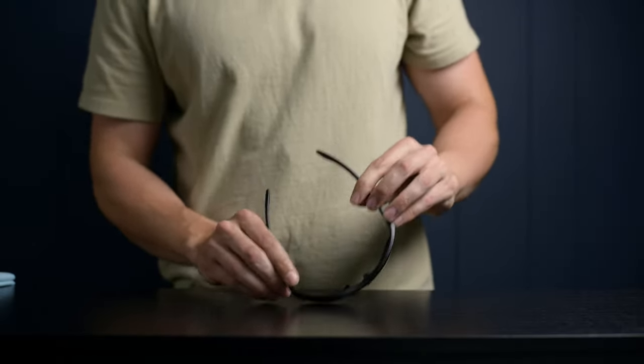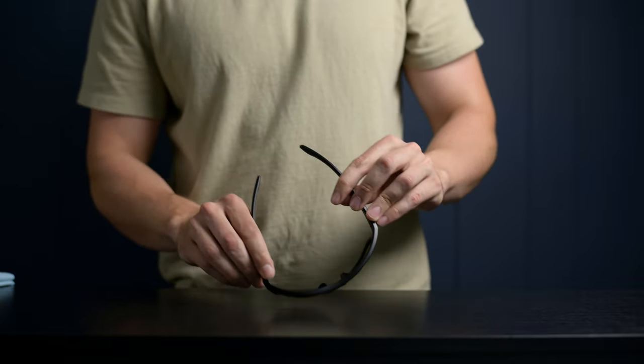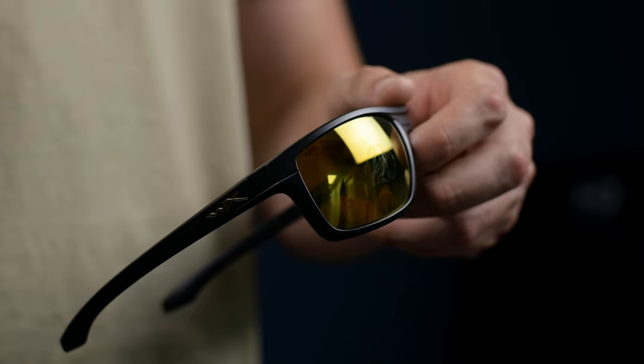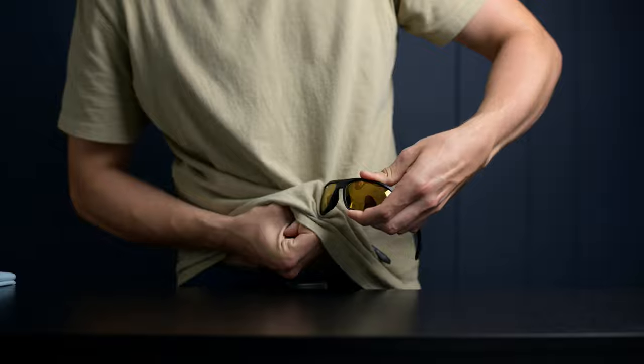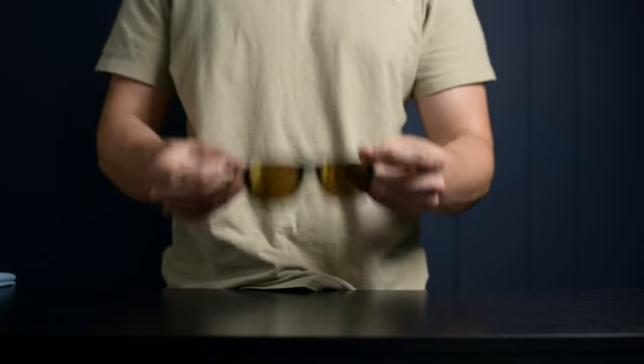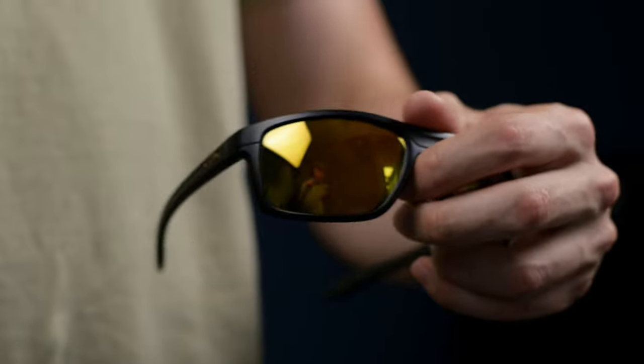I'm just rubbing the lens against the table, trying to get it all scratched up. As you can see, it left some smudges on the lenses, which we're just going to clean using my shirt. Get it nice and clean. And as you can see, now they're perfectly clear. These lenses held up pretty well, since they have the protective coating applied.